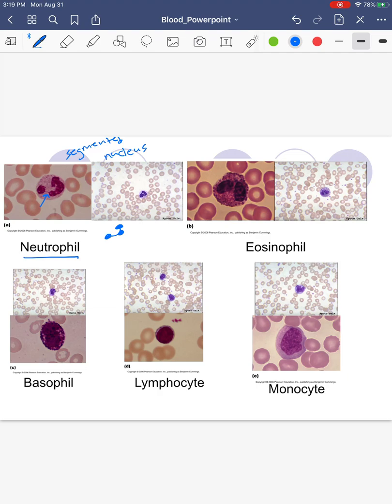An eosinophil is going to have 2 big lobes in its nucleus. So it's one nucleus that has two big lobes. One of my colleagues thinks it looks like earmuffs, but I just can't help it. To me, they look like boobs because we've got two large ovals next to each other. Eosinophil.